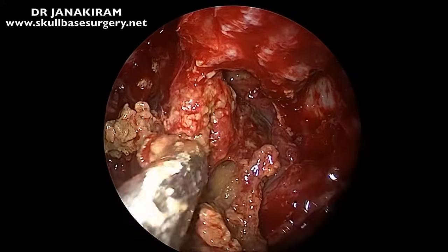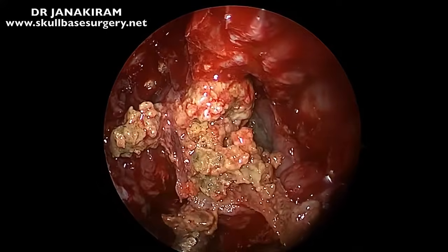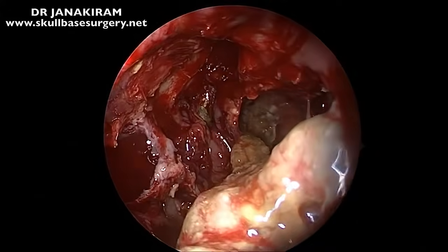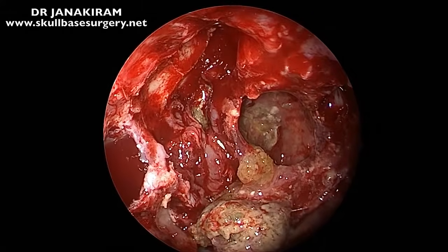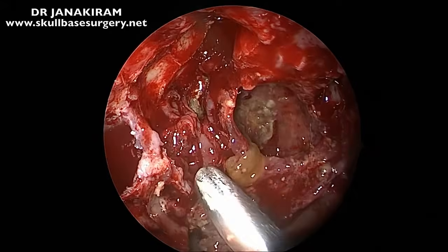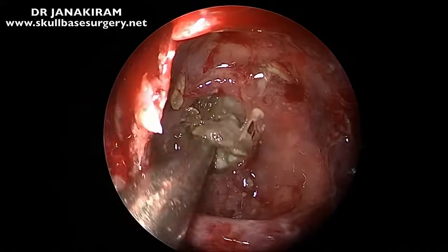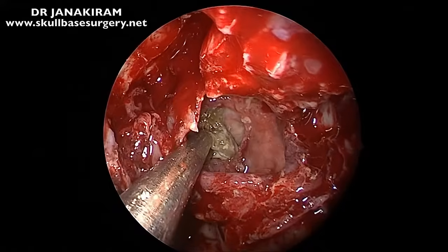It is not advisable to use the debrider inside the sphenoid sinus, nor is it advisable to use very forced irrigations. Now you can see that the mass is coming out. We're taking a Takahashi forceps to remove it, send it for culture, and the mucosa is taken for biopsy.